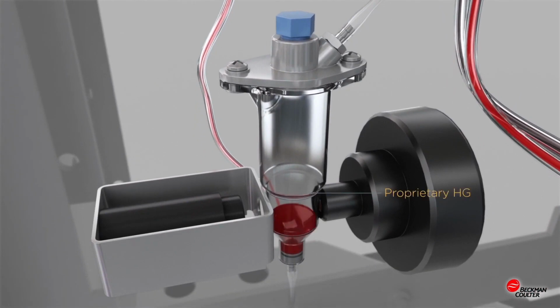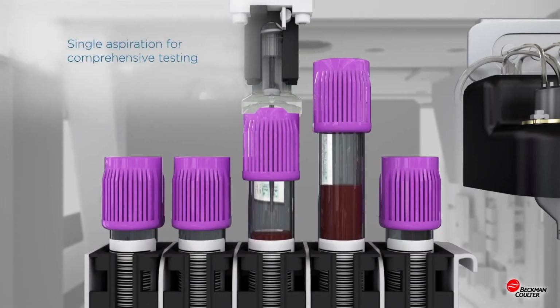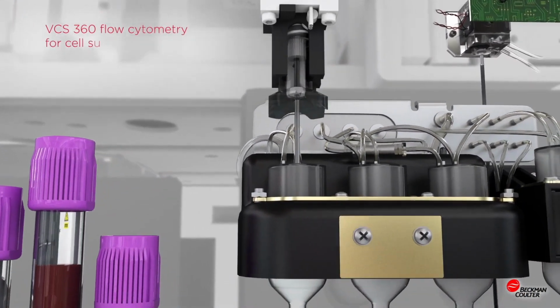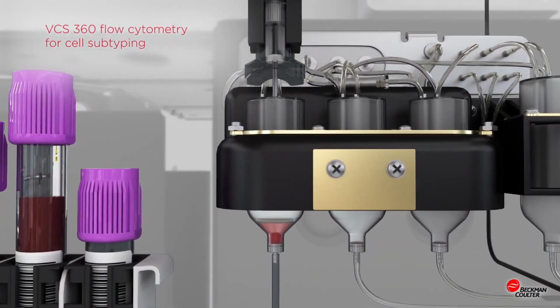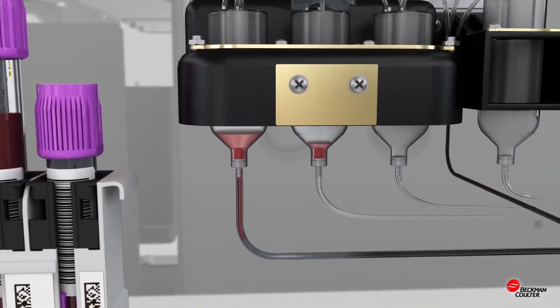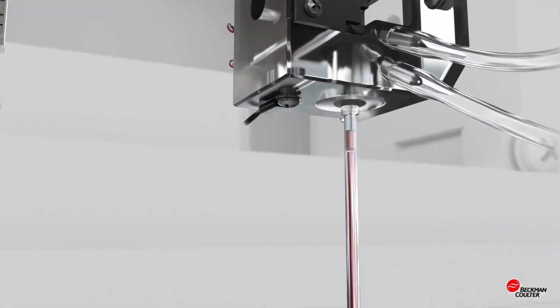As the vacuum draws the sample cells through the orifice, the cell momentarily causes electrical resistance to the current as it passes through the orifice. This resistance is recorded, measured, amplified, and processed, which can then be interpreted by the computer into a histogram. The 3-part analyzer is able to differentiate between 3 types of WBCs: neutrophils, lymphocytes, and monocytes.